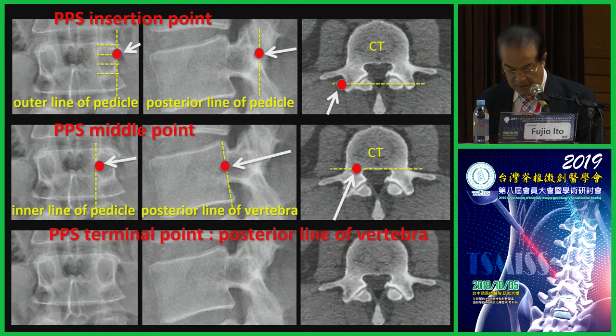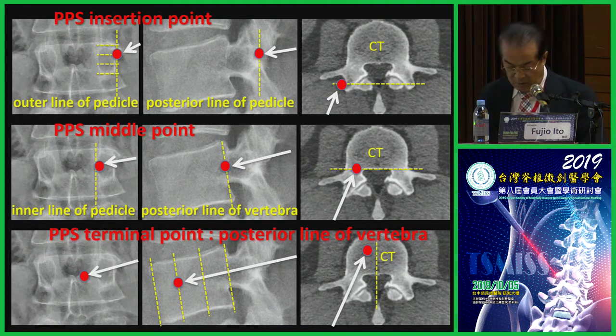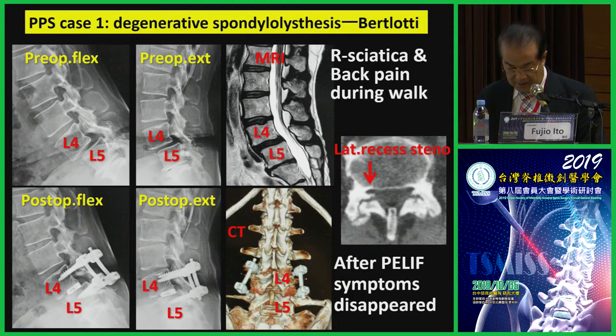PPS terminal position. The final target point of PPS is slightly lateral to the center of the vertebra in AP view. In the lateral view, the needle tip is at the anterior 1/3 of the vertebra. In CT, the tip of the needle is slightly lateral to the center of the vertebra, and at 1/3 of the anterior. This case had right sciatica and back pain during walking due to L4-5 degenerative spondylolisthesis and instability at L4-5. After PE-LIF, symptoms disappeared.